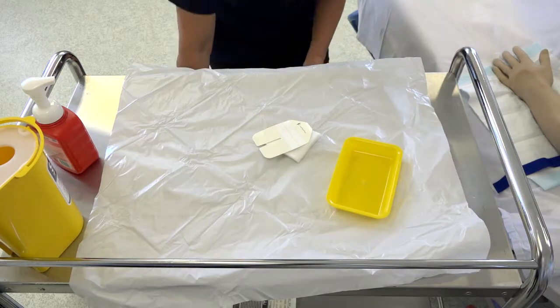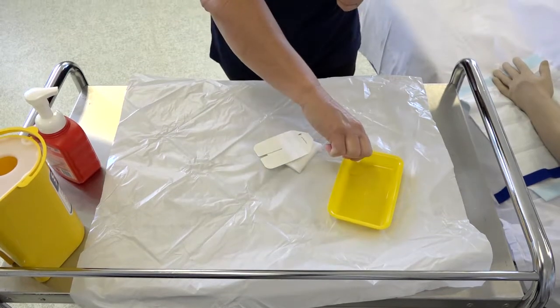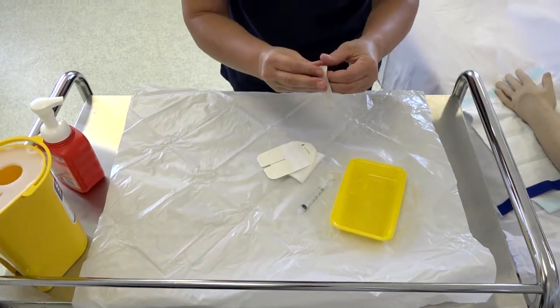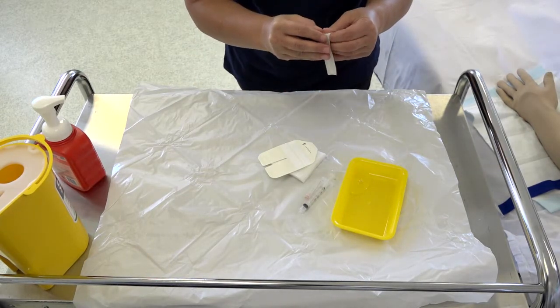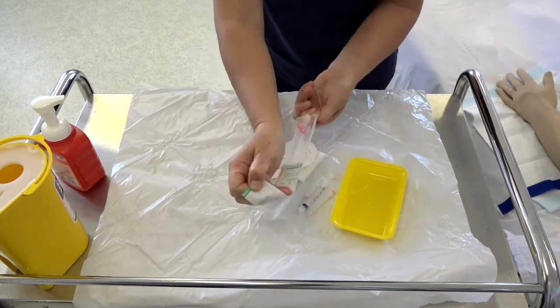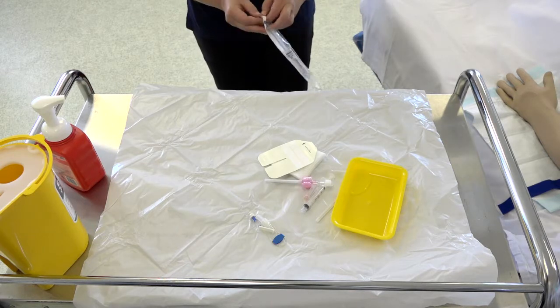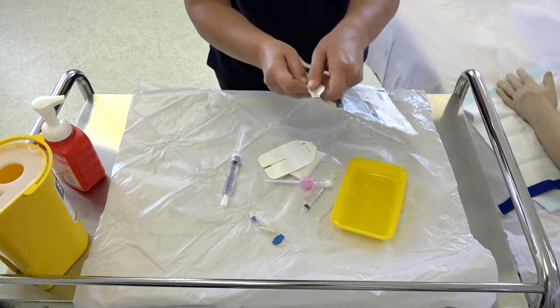Prepare the sterile zone. Pour 1% lignocaine into the yellow dish. Open the 3ml syringe, the 26 gauge needle, the drawing up needle, your cannula, your J-loop, your 10ml prepackaged flush, and your sterile gloves.